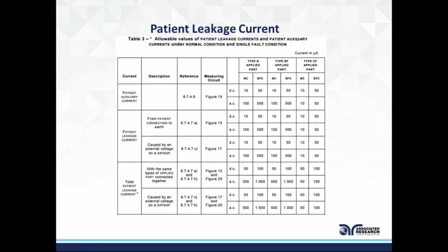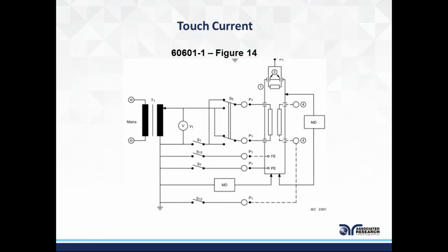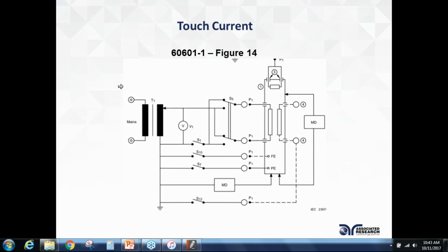So let me go back a second. When we talked about figure 14, this is the touch current section of what the standard is calling out. So if you see in your documents that it says, oh, refer to figure 14, or we want to perform this test according to figure 14, initially this image may look like there's a lot of stuff going on here, but to simplify it, let's take a look at what this is.